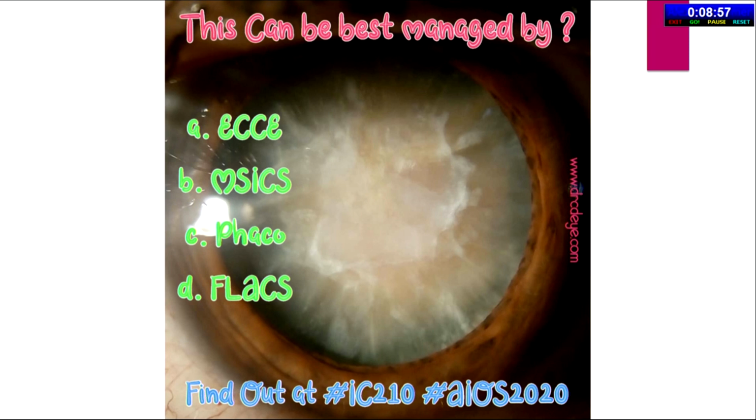Let's raise hands for A, for B, for C, and for D. Okay, as by counting the hands also, it was SICS which could do justice in this case. And suppose it's an old patient with this kind of plaque and cataract grade, SICS would definitely give a better visual outcome. It will give a pristine cornea, especially on the next day.